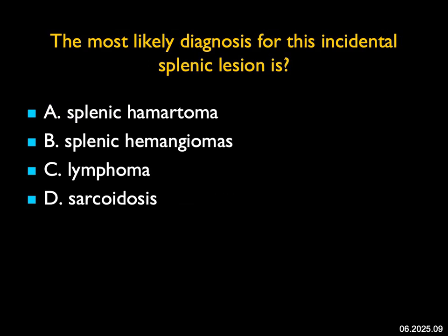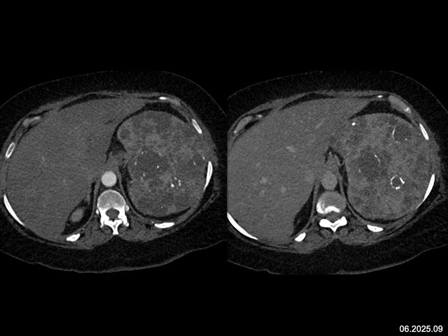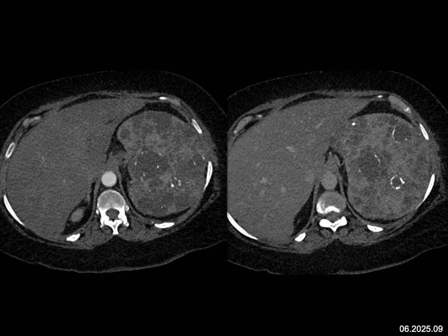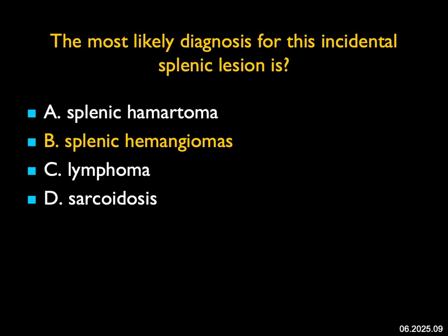The most likely diagnosis for this incidental splenic lesion: the spleen is enlarged with multiple cystic lesions with rim-like calcifications. Hamartomas can be multiple but are usually solitary, and when multiple they're large and tend to extend beyond the surface of the spleen. Lymphoma is typically infiltrating — you do not have calcifications with lymphoma. Sarcoid can give a big spleen with lesions, but the lesions don't calcify, and you usually also see disease in the liver. Splenic hemangiomas can produce a large spleen with multiple calcifications, some calcified and some not. Klippel-Trénaunay-Weber disease gives you the largest spleen with multiple hemangiomas and calcifications present.